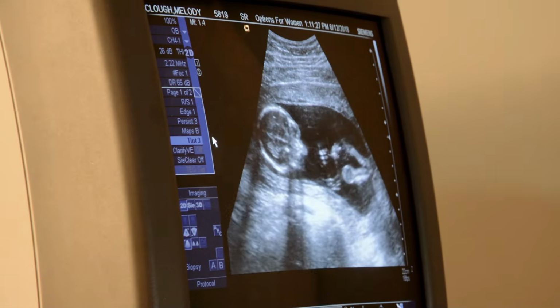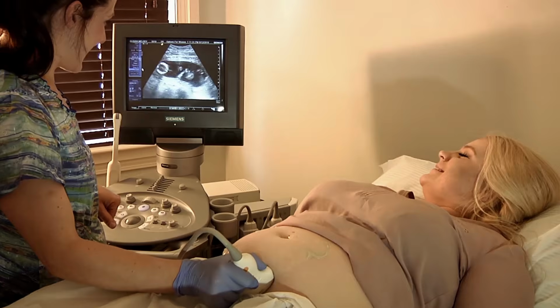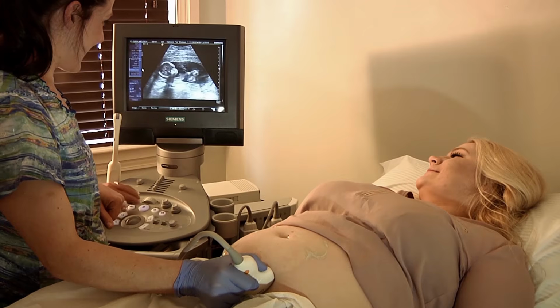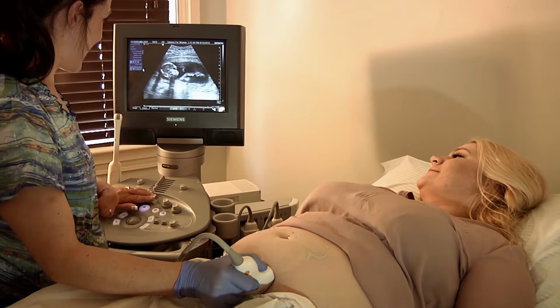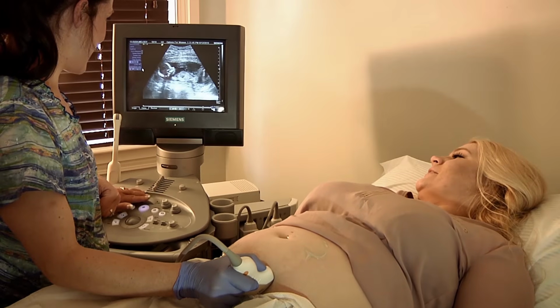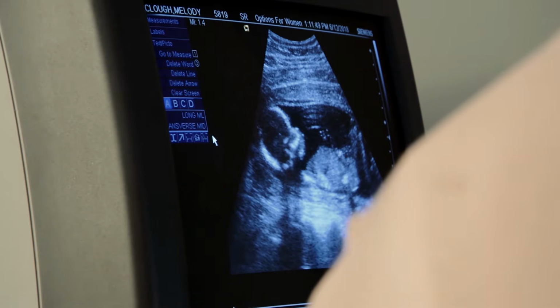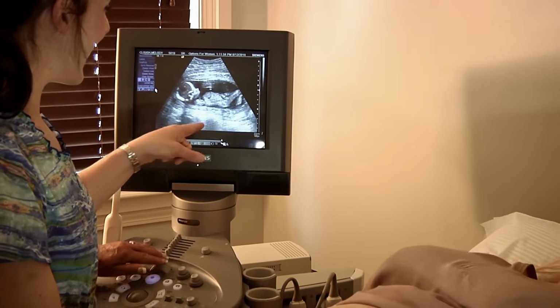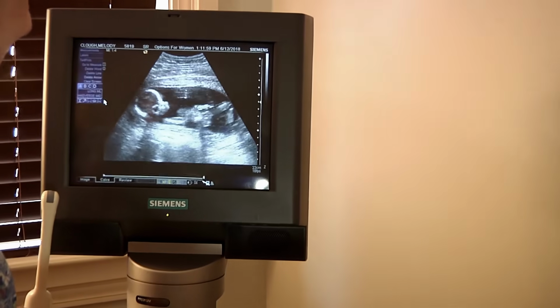Can you see it okay? I see some cute pictures in there. Let's go and see what pictures you want to get. We got that. You tell me which ones you like, Mom. Oh, that's a good one. I like that one. Okay, we'll take that one. Oh, I like the booty. Let's get the booty. All right.